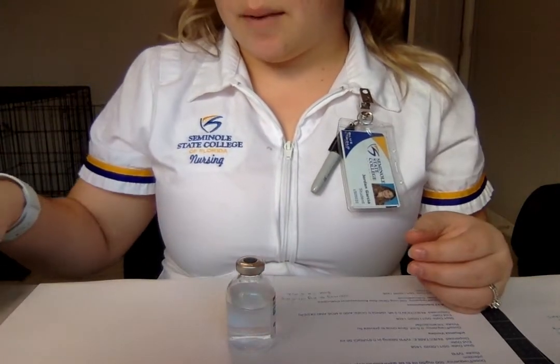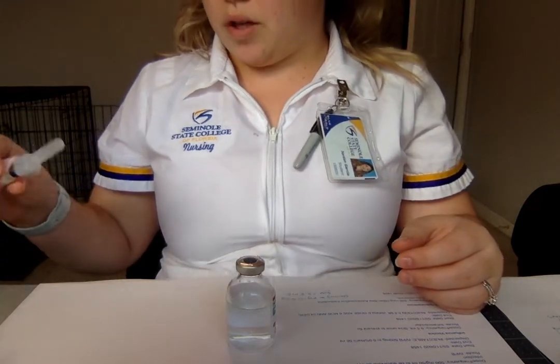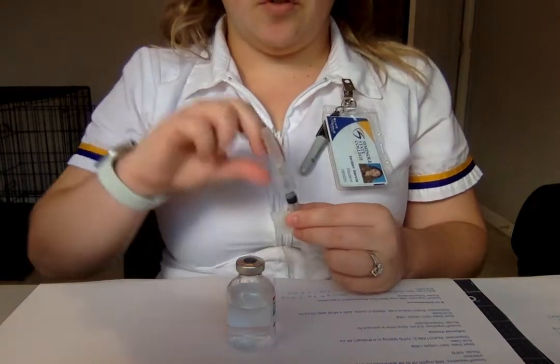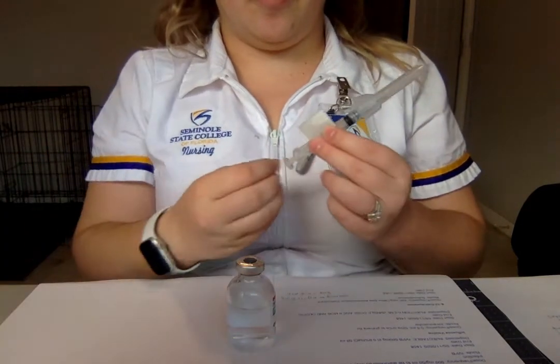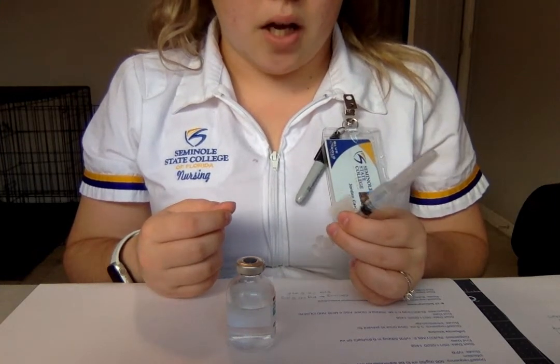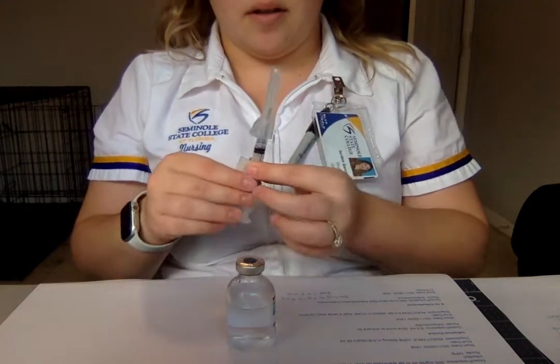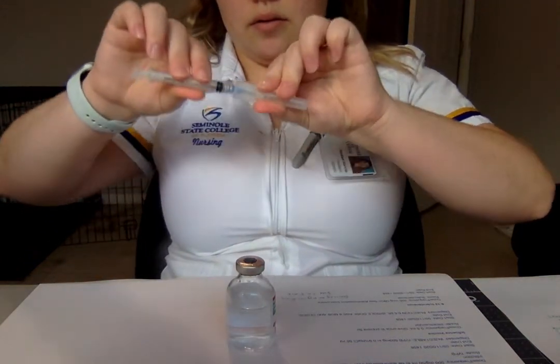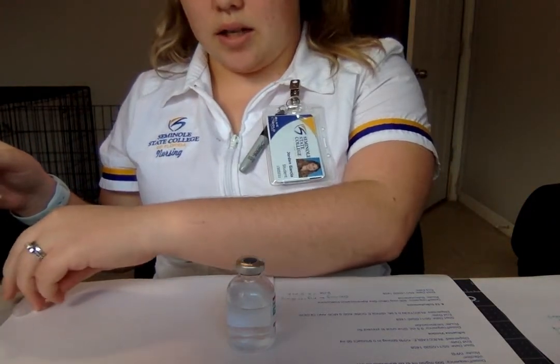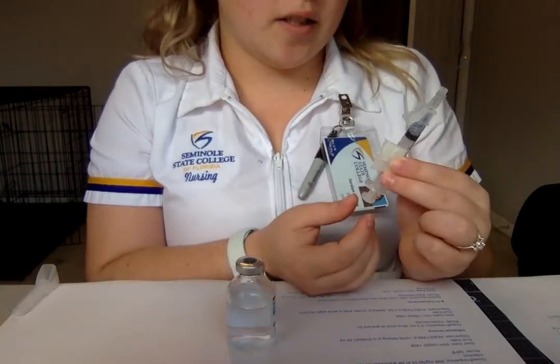And then I'm going to get my 23 gauge needle and my 3 ml syringe. And I am going to do the rainbow cap, and then I am going to pull back the same amount of air into the needle as the dosage. So I'm going to pull back 0.5 mLs of air. I'm going to set this over to the side so I can do my one-handed scoop. So I'm going to now draw back 0.5 mLs of air.